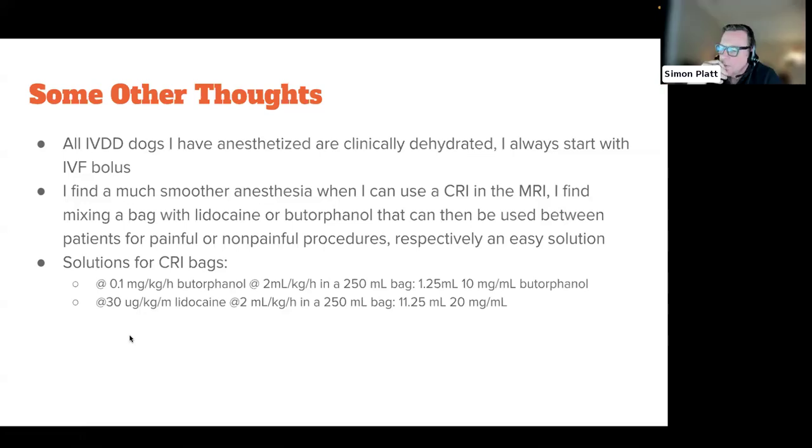Okay. All right, so I think one last question I have here is, bearing in mind that a big focus in MRI is to keep movement of the patient to a minimum, do you find more comfort with inhalant versus total intravenous anesthesia, or do you not really see much difference between the two? I think if you dose appropriately, the TIVA actually is just as good as the inhaled anesthetics. Because I'm using propofol or alfaxalone to maintain my anesthesia, I still see some vasodilation.